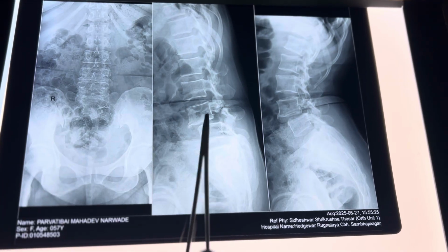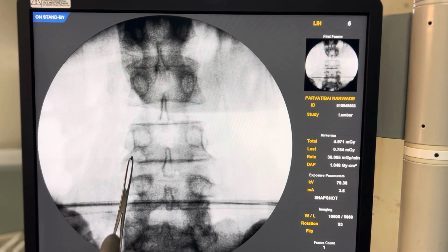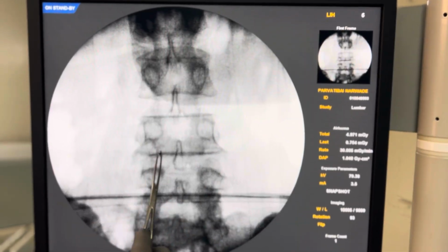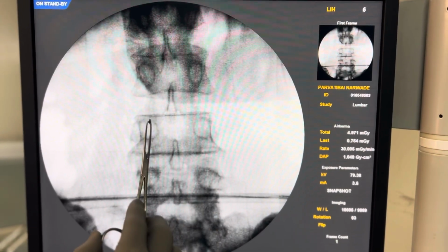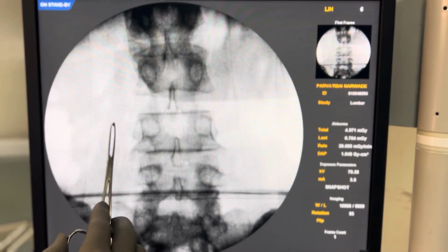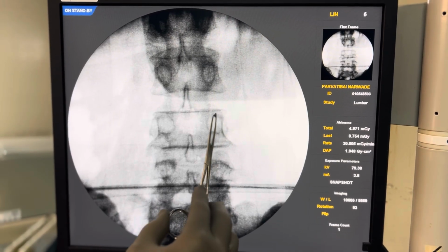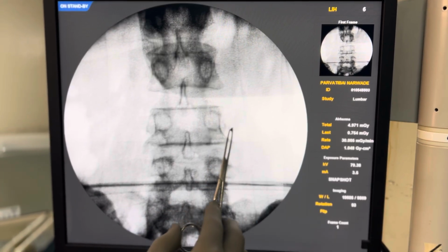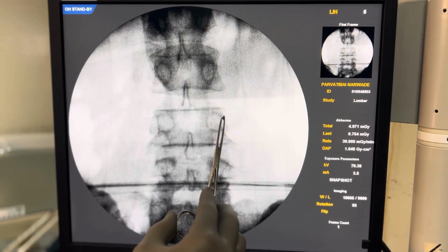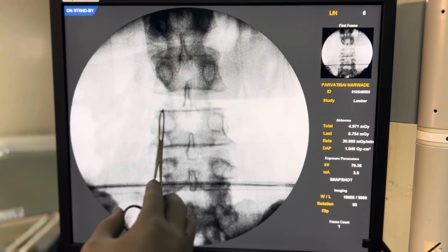For this case, we are using percutaneous pedicle screws, which we are going to demonstrate. This is the L4 vertebra. These are the pedicles. These are the transverse processes. One should be able to clearly see the pedicles and transverse processes. Sometimes the transverse processes are not visible, that's okay, but the vertebra should be squared so that we can see the proper pedicles.